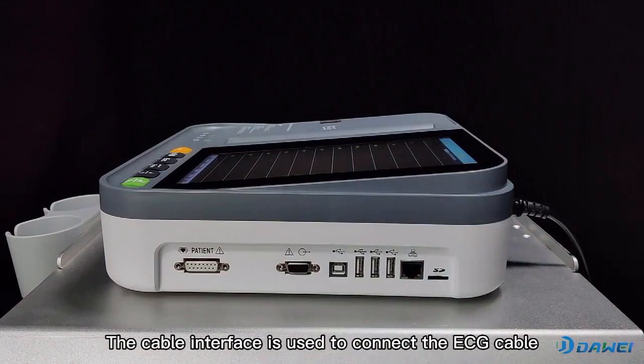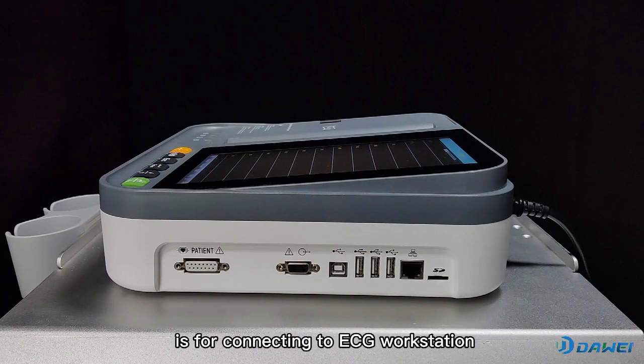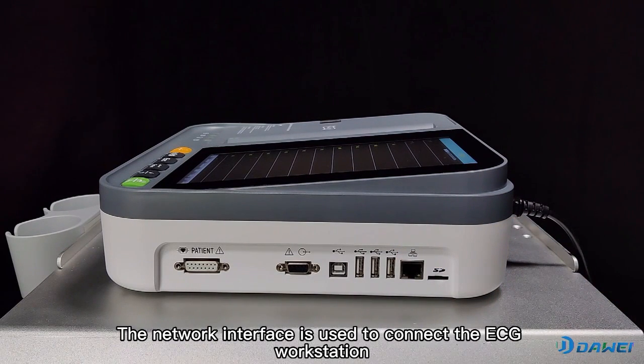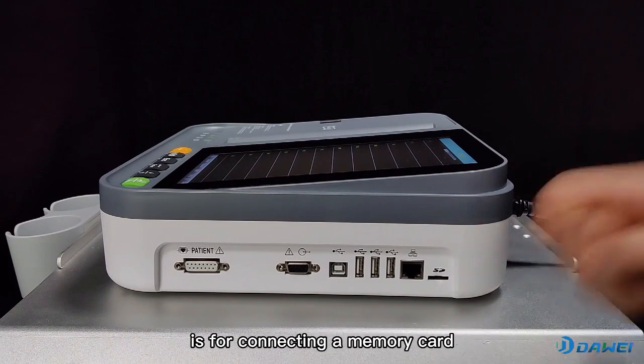The cable interface is used to connect the ECG cable. The RS232 interface and square port USB are for connecting to an ECG workstation. The USB interface is used for external storage and data transfer. The network interface is used to connect the ECG workstation. The SD card interface is for connecting a memory card.